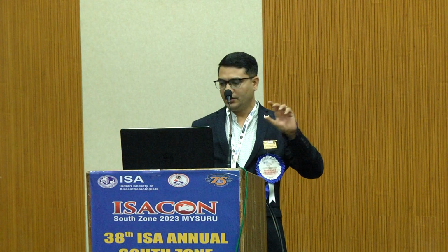For venous blood, there will be static, there won't be a change in the volume or amount of hemoglobin. But in the case of arterial blood, there will be changes. That's why in most pulse oximeters, we can identify the arterial pulsatile hemoglobin level based on this principle. Coming to the causes of errors.